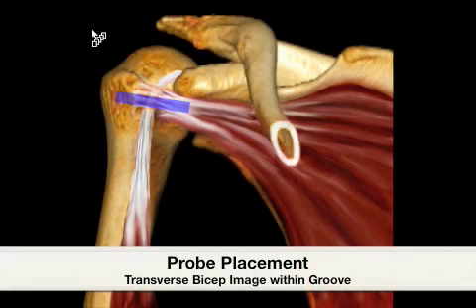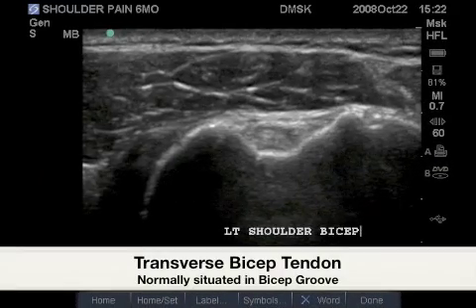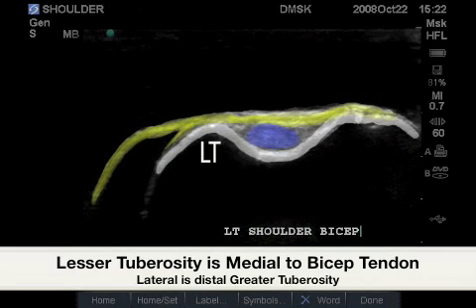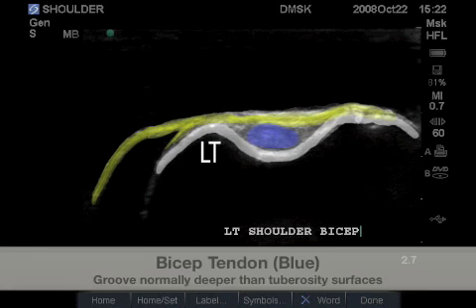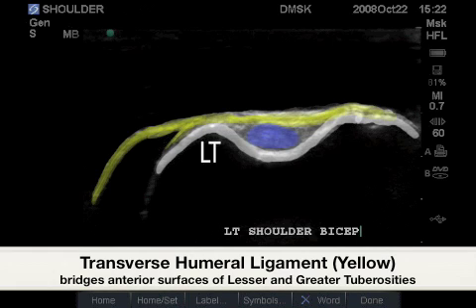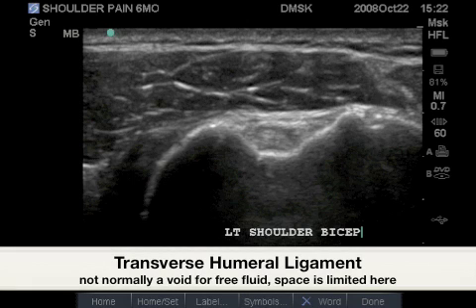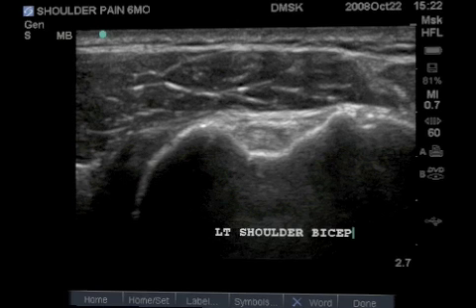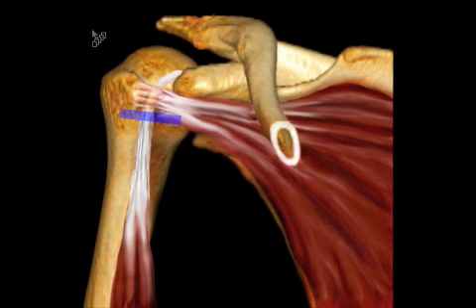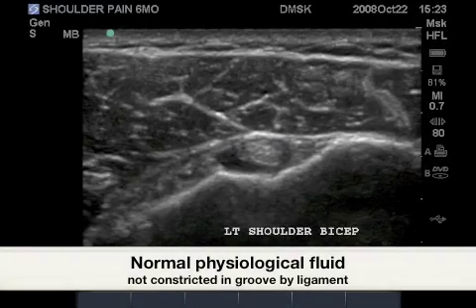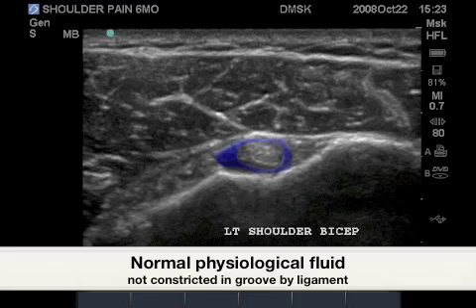Probe placement for the transverse bicep image begins over the bicipital groove between the greater and lesser tuberosities. Here we have the lesser tuberosity labeled as LT. The bicep tendon is colored blue, and the transverse humeral ligament is yellow. A stable bicep groove will be lower than the greater and lesser tuberosities. Just distal to the bicep groove, it is not uncommon to see a small amount of normal physiologic fluid accumulating surrounding the bicep tendon.